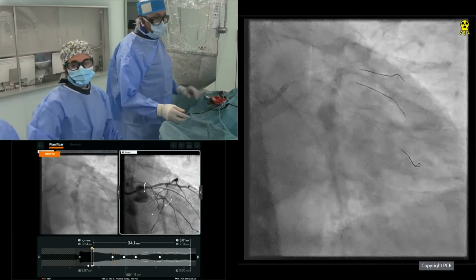You are not stretching a plaque in the left main. Well, perhaps in this case a bit. But it's worth it, we believe. It may take you a few extra minutes because you have to perform it, of course.